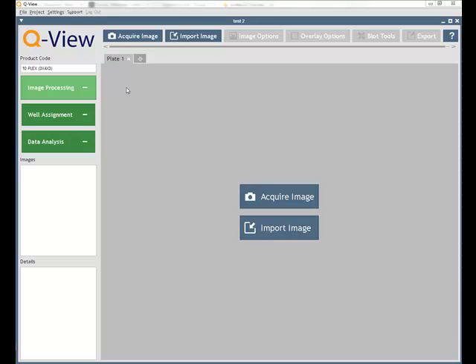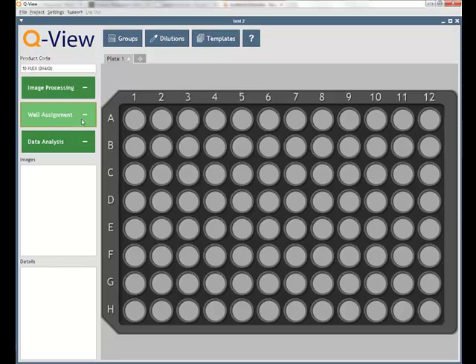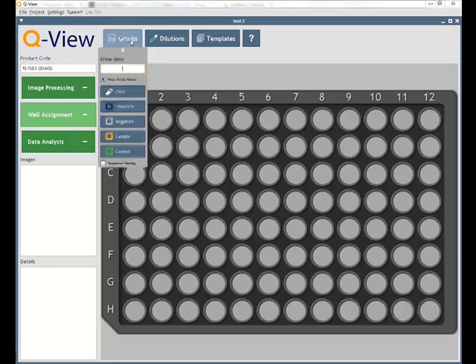Using QView, multiplex analysis is performed in three easy steps. We begin with image processing, which includes capturing or importing images of your micro-well plates and aligning the plate overlay to fit the wells within each plate. In well assignment, users can assign groups, name wells, and apply dilution factors.